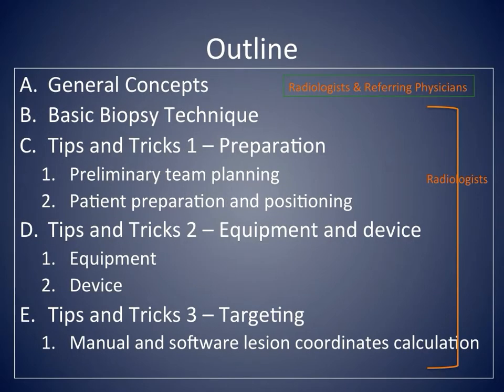We have divided the topic in 5 sections for easy reference. The first section, General Concepts, is a general overview that can be of interest to radiologists and physicians referring the patient for the procedure. The remaining 4 sections are for radiologists.